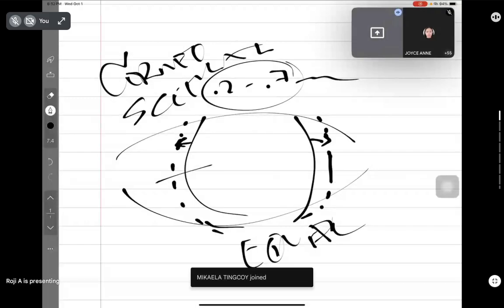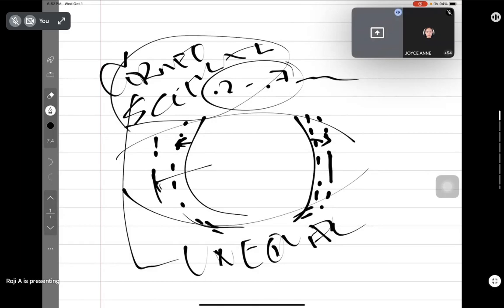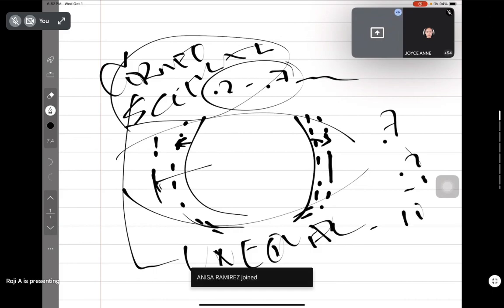So you want that equal. If it's not equal, then for example like this, and then this one is over here. So this is what you call unequal corneoscleral overlap. And whenever you have this, it is most likely not acceptable, especially if it's beyond 0.7, right? Because what's accepted is 0.2 to 0.7. So if it's beyond 0.7, such as 0.8, 0.9, or even 1.0, then it's not going to be acceptable.